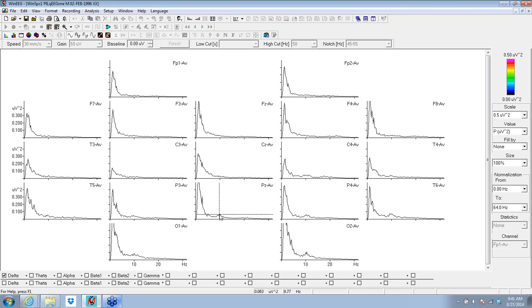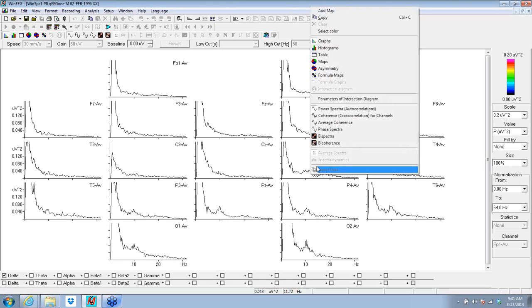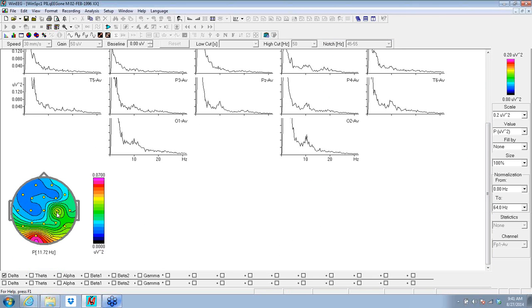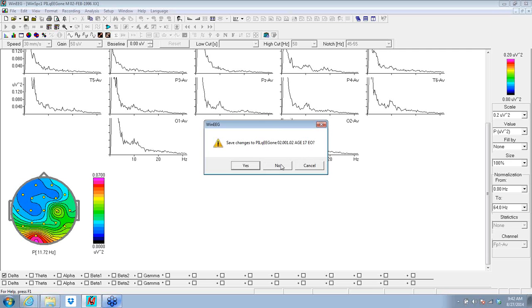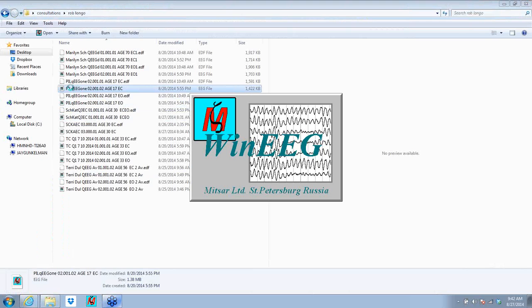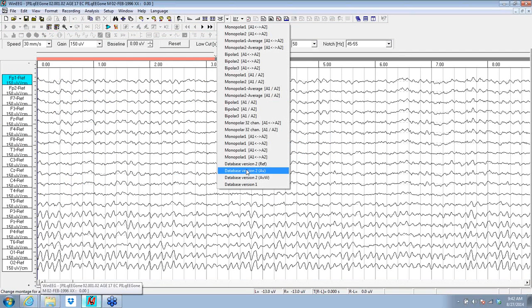There's a little touch of content up near 10 hertz, the 9 plus, 10 hertz range. The little bit of mu that happened was slightly faster than that. The right side. So a mu on the right side. This is only the eyes open. We've got eyes closed to look at as well, treating the EEG equivalently.